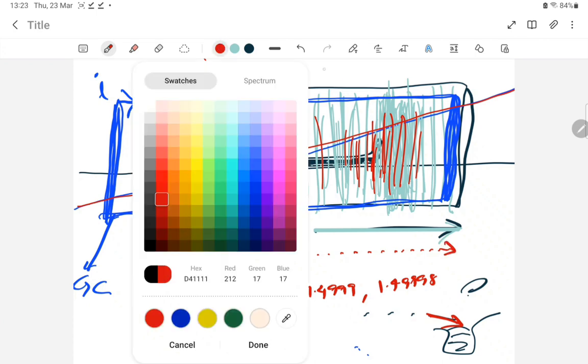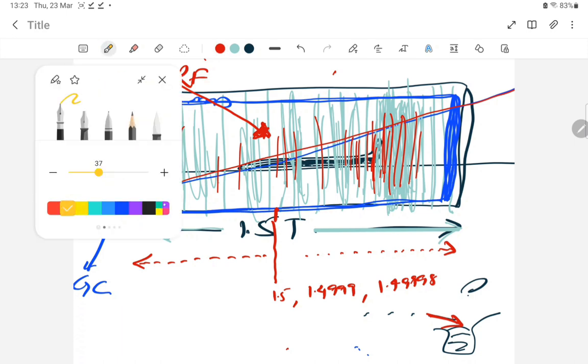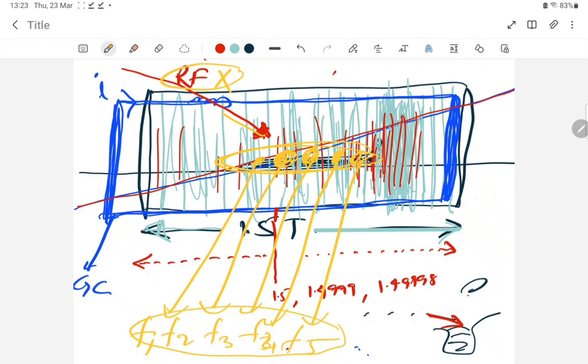What will happen? Now we will give an RF energy to the patient. This patient's body will release energy, because whatever organ you want to see, you are giving an RF. Now you are removing this RF and collecting. You will see different frequencies from different points of the body, and this is your objective. Then you will see a frequency spectrum.